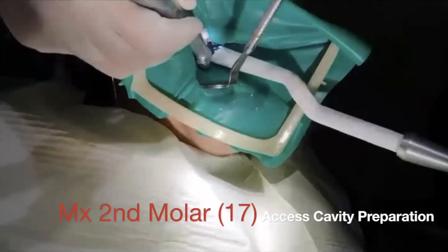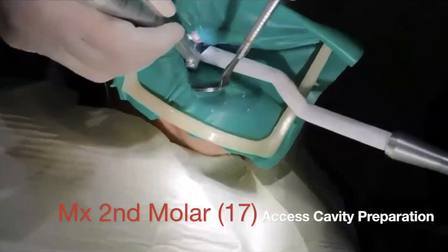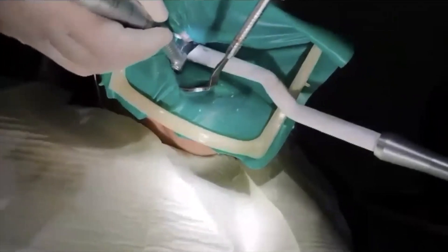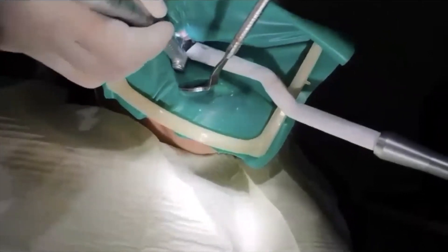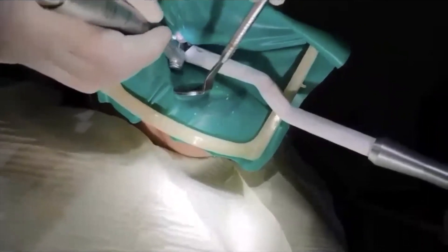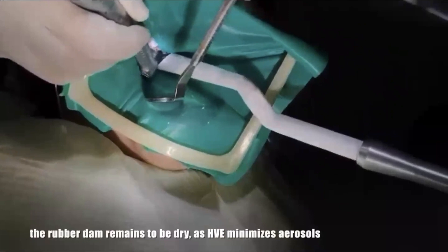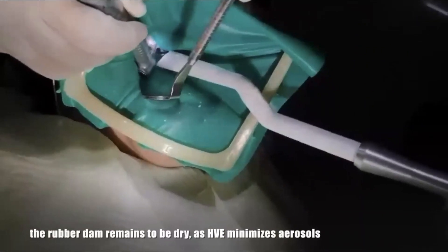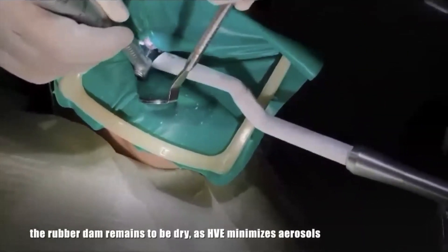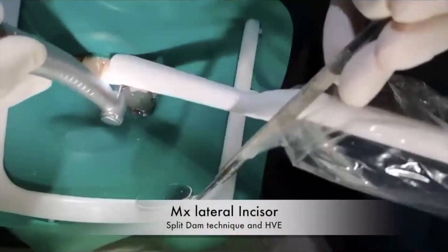My first case is a maxillary second molar, tooth 1-7. The tooth was suffering from symptomatic irreversible pulpitis. After anesthetizing the tooth, I placed the rubber dam and started to remove the carious lesion and proceeded with access cavity preparation. As you can see, the rubber dam sheet is still dry, even after 24 seconds of drilling.